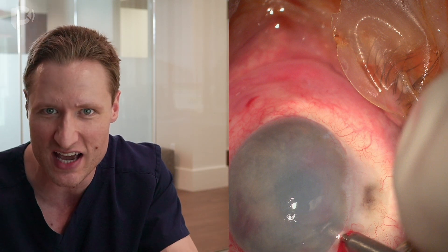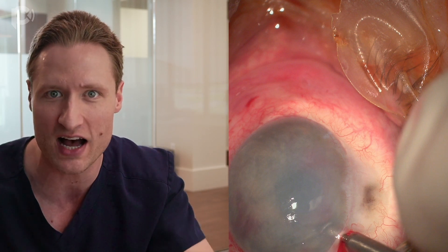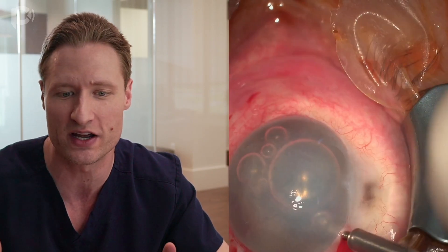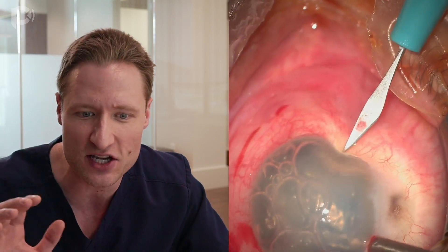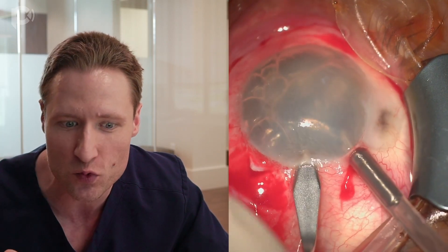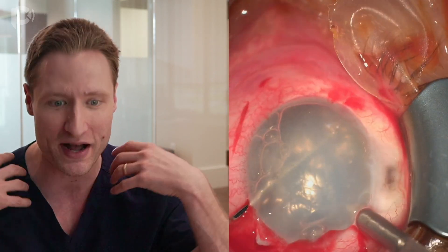I'm vitrectomizing the eye with no fluid going in — a dry vitrectomy — because I want to soften the eye and remove content from behind the iris. Now that the dry pars plana vitrectomy is done, I stick the AC maintainer into that single paracentesis and turn it on air. An assistant with a 60cc syringe fitted with air is pushing, and you'll notice as he pushes the chamber deepens. That gives me room to make accessory paracenteses and the main wound using a 2.4mm keratome directly temporally. First remove volume from behind the iris with dry vitrectomy, then put air in the AC to blow everything back.